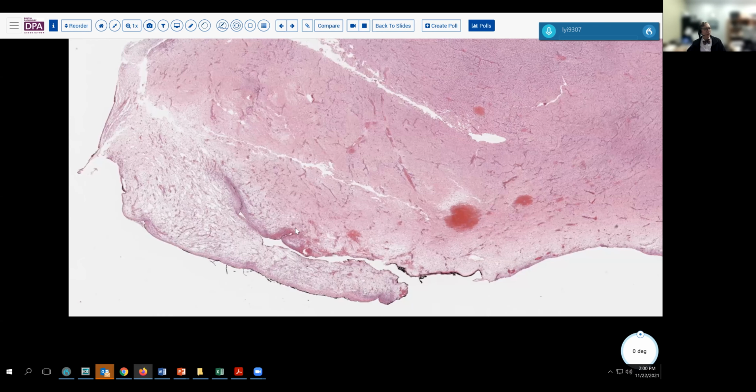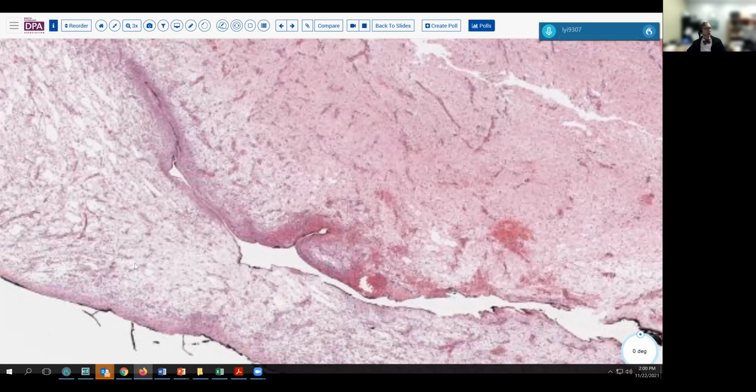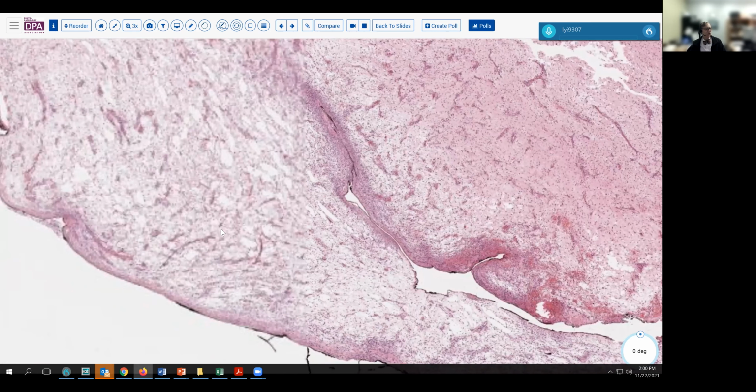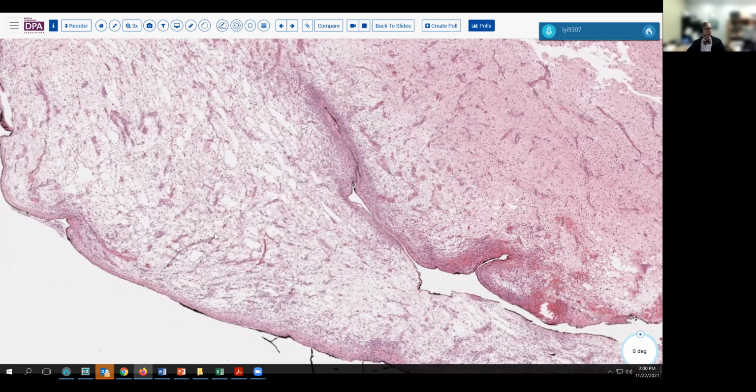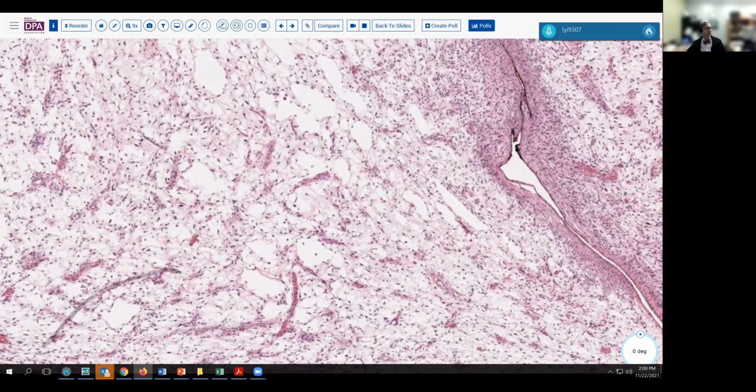So typically, well-differentiated liposarcoma in the retroperitoneum has some peripheral areas where you have well-defined fatty tissue, or in this case, not so well-defined fatty tissue, but a more low-grade appearing lesion. This is slightly spindled here in the subperitoneal areas. As you can see, here's the peritoneal surface, and here's this tumor with a very low-grade spindle cell appearance.